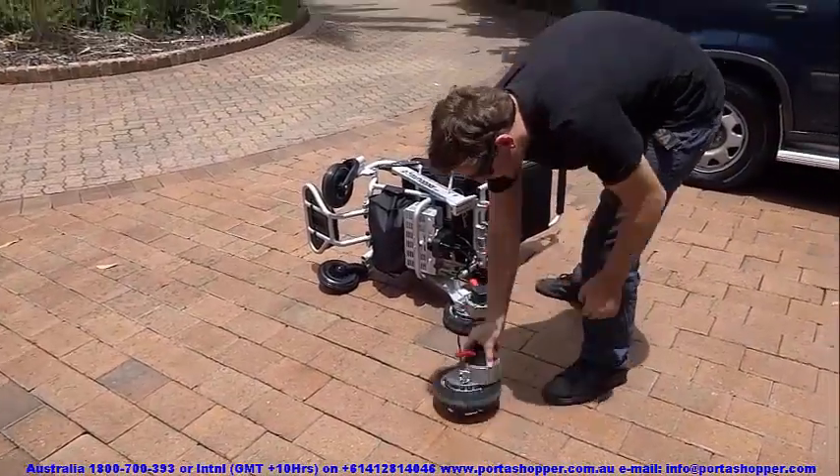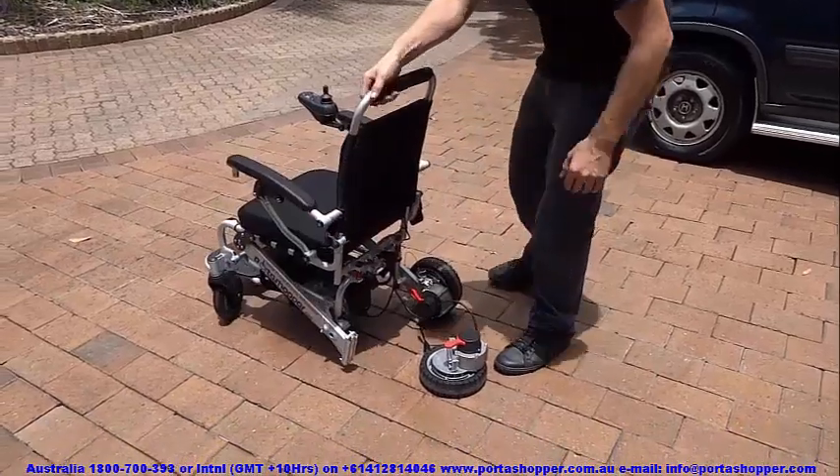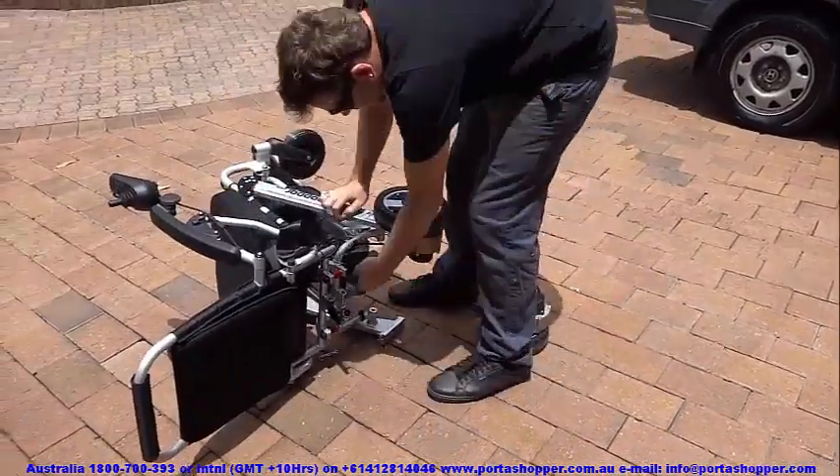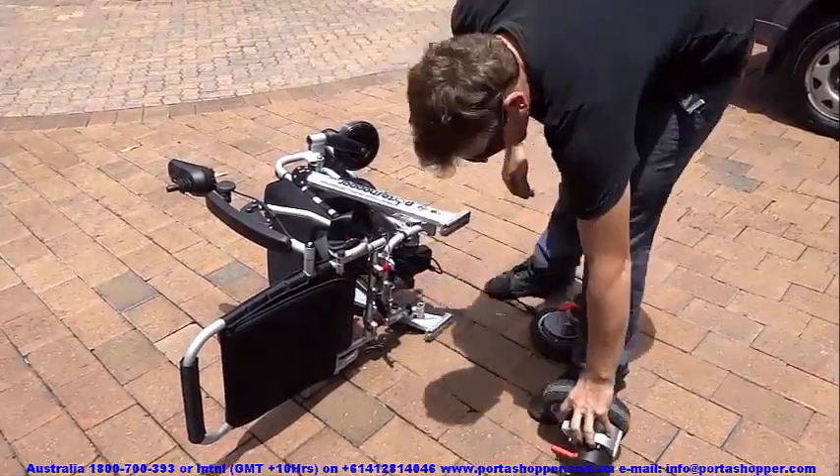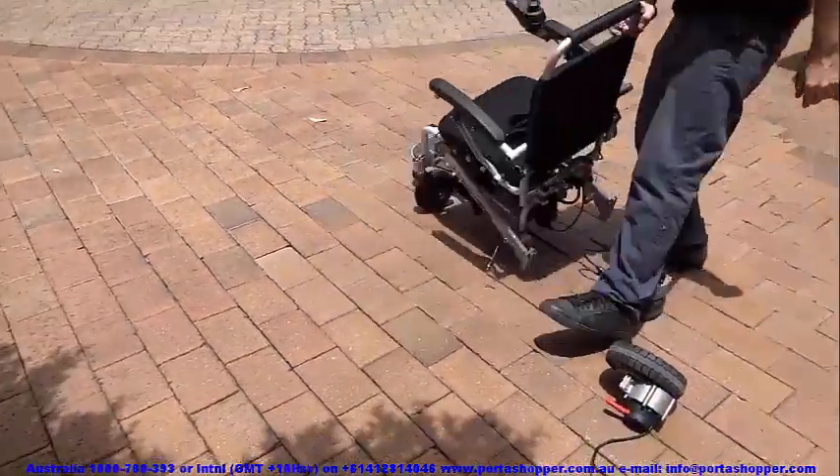Another great benefit of the PortaShopper 3 is that it has specially formulated solid but slightly spongy front casters, which are ideally suited for indoor and outdoor environments and even high friction areas such as thick pile carpets.